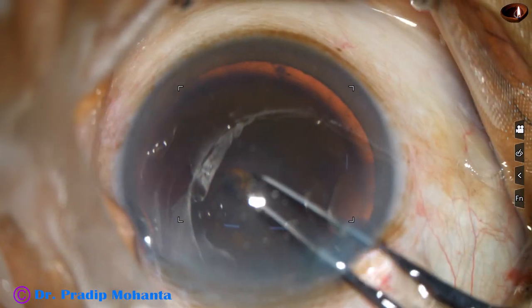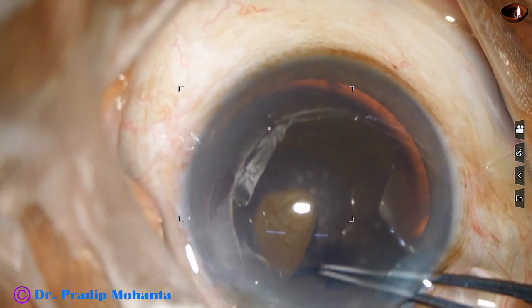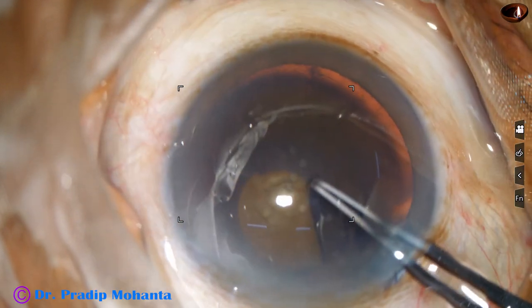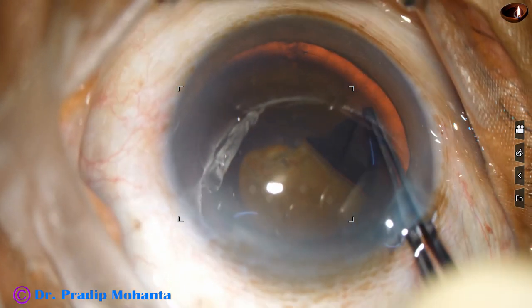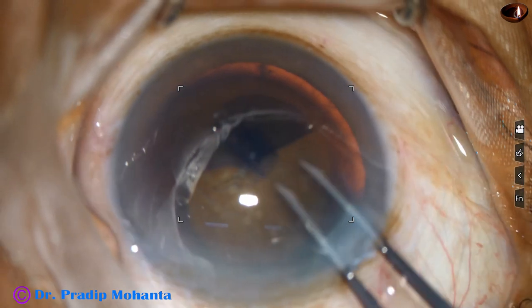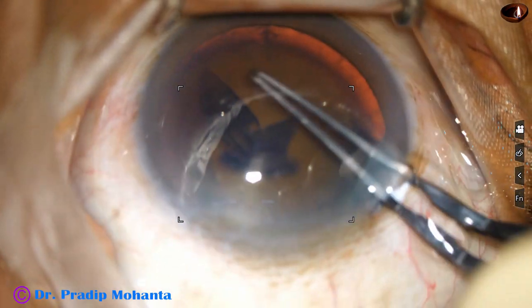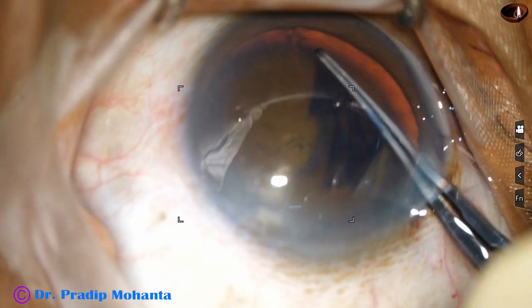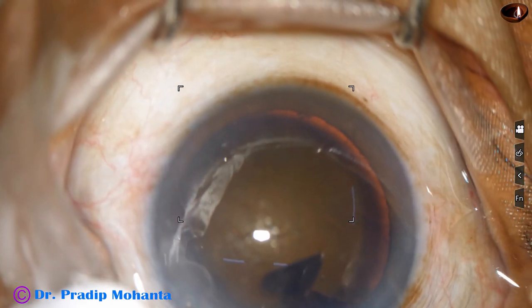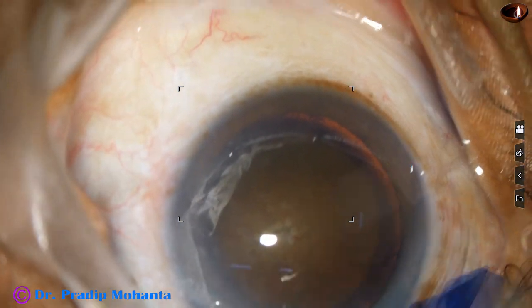The anterior capsule is torn by the tip of the utrata forceps. The capsular tag that is created is guided all around. And in this case, since this is a hard cataract, I am doing a large rhexis. And this has been a very satisfactory round large rhexis.